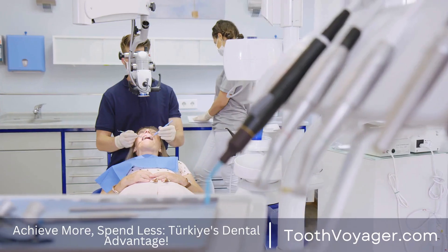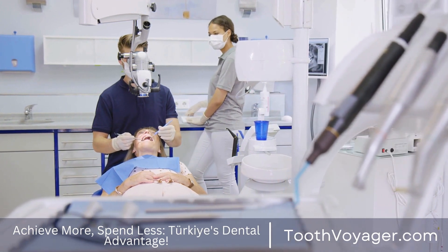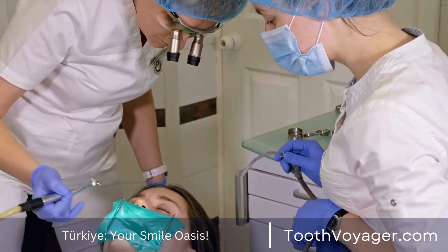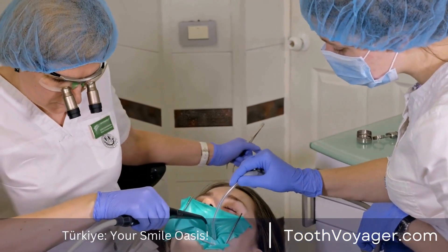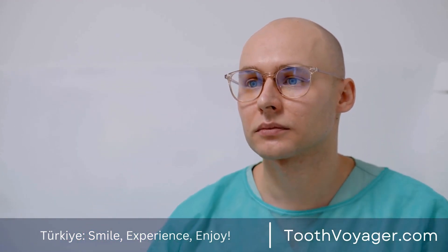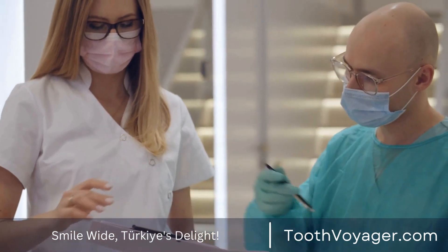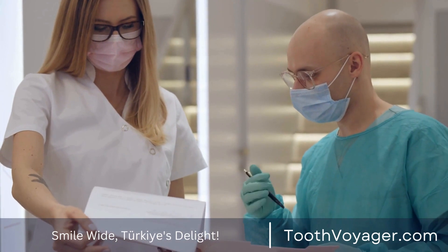In the following appointment, the dentist will put on the bridge and perform any adjustments necessary to ensure it fits properly. The bridge will be sent to a lab which will make it custom to suit the individual's mouth. While waiting, the dentist could put in a temporary bridge for protection of the teeth and gums. After the permanent bridge is ready, the patient must return for a second visit to get it fitted, and the dentist will inspect the fit and cement the bridge in place.